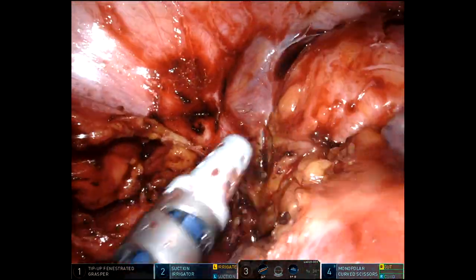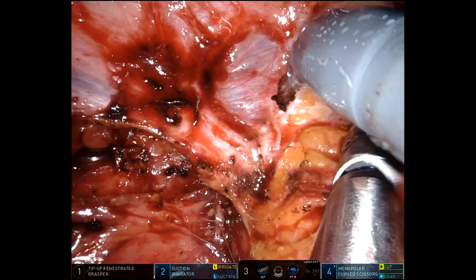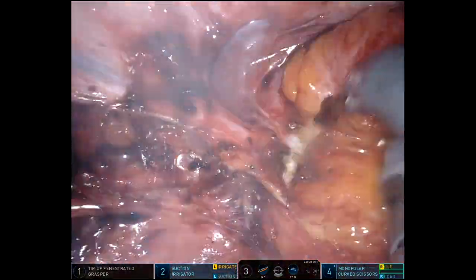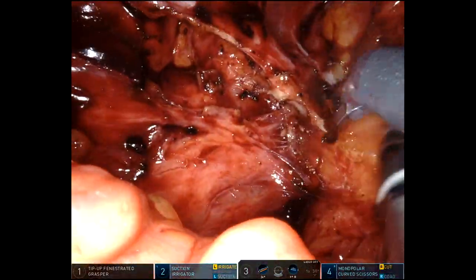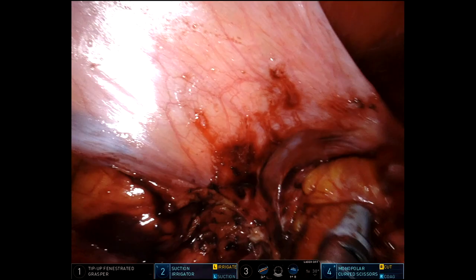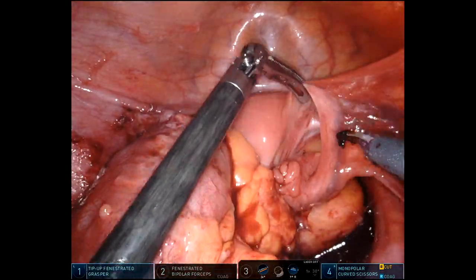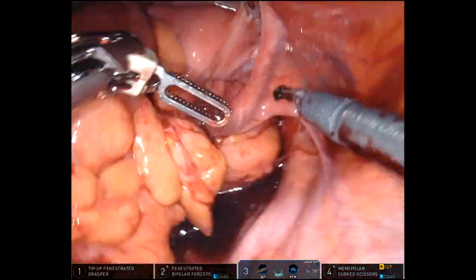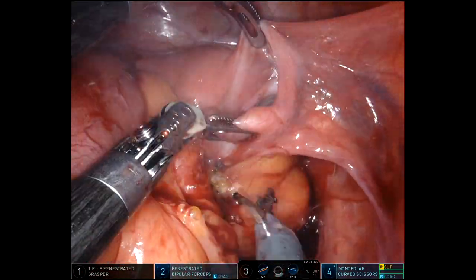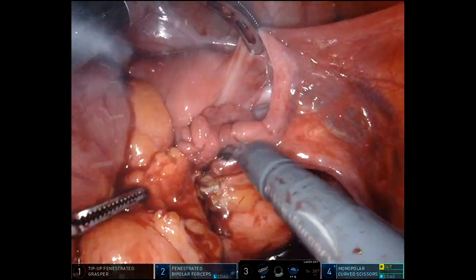Obviously these operations can be done laparoscopically, but I find that with the strength of the robotic arms — being able to get the torque we're getting here for retraction — robotic is a lot easier in my hands.